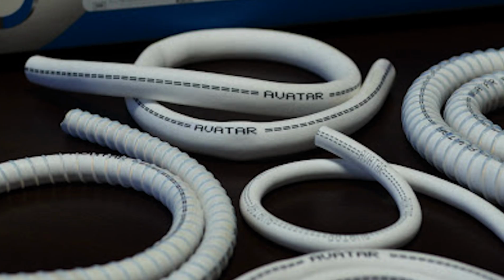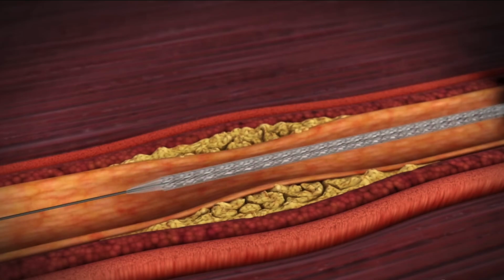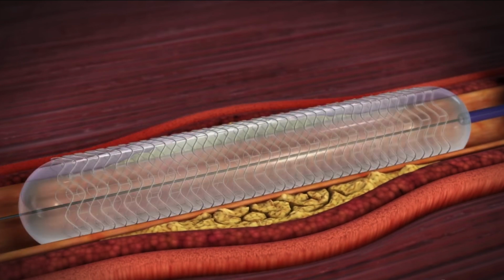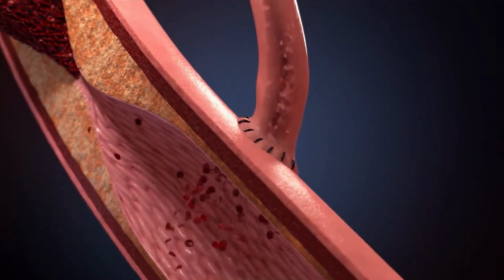The problem with the grafts currently used is that the materials used to repair cardiovascular structures have basically remained the same since the 1960s. The current technology is good enough for certain applications, but it is definitely not good for all. When a person has a blocked artery, the first option is to implant a stent, which is angioplasty, or to take a vein or artery from the leg and use it to replace the clogged one, which is bypass, or CABG, which is coronary artery bypass graft. That comes with its own problems.